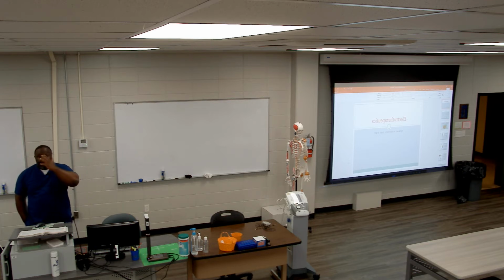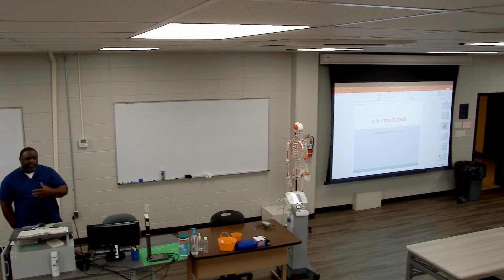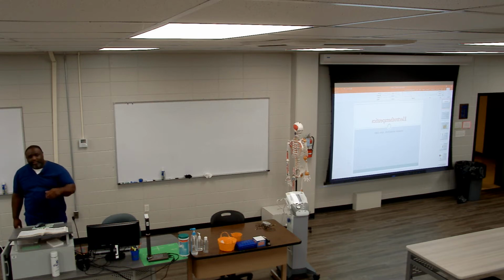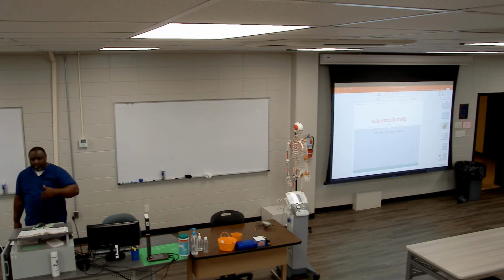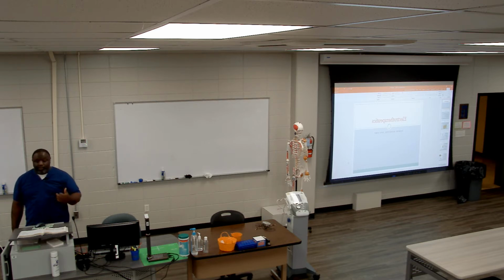E-Stim is one you shouldn't go a day without seeing in some capacity if you're working in an outpatient setting. Inpatient setting, you may or may not see it, just depends on the patient type. I've used it in inpatient before. If I've had a post-op total knee replacement patient who just can't seem to fire their quadricep muscle, and I want to get the quadriceps stimulated and the femoral nerve reawakened, I'll use it for things like that. So I've used it in acute care.